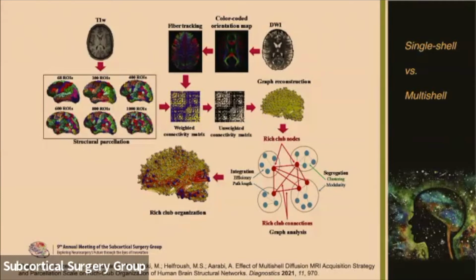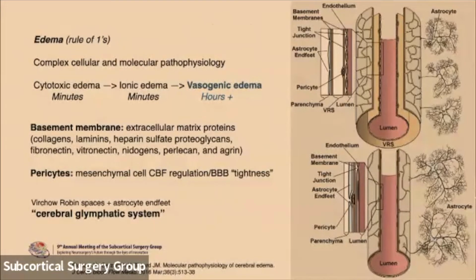We wanted single shell bicompartmental acquisitions on MRIs that could be available in your regular practice, a 1.5T. And so the study is based on a bicompartmental model that tracks through edema, eliminates free water using the paradigm that assigns a voxel to water or to the diffusivity, the average diffusivity of water, and a tensor to the underlying white matter tissue.